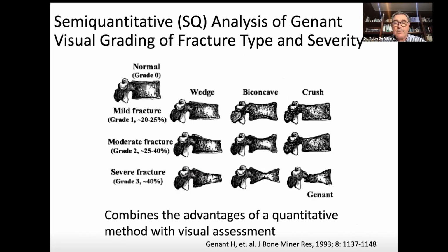And this is just to show we actually use the semi-quantitative analysis of Harry Genant. Harry unfortunately passed away earlier, late last year.